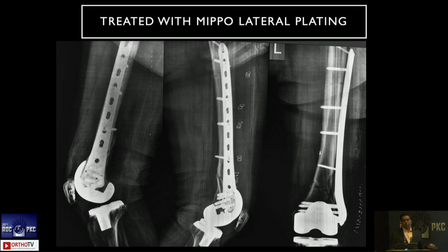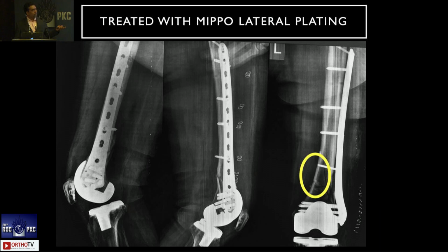So again, there are multiple options of managing this case. We can do this case with a nail, with a plate, or use 2 plates, or use a single plate. But as we could get a medial stability or a medial continuity as the comminution was central or lateral and it was done in a minimally invasive fashion, maintaining the biology, I didn't feel a need to put a medial plate or add an extra fixation.